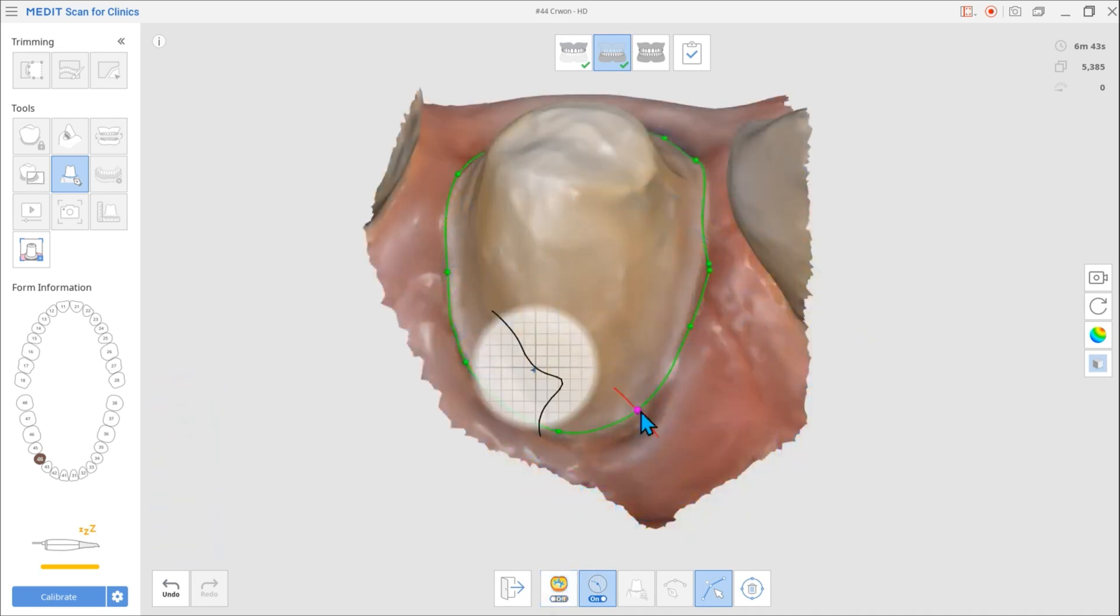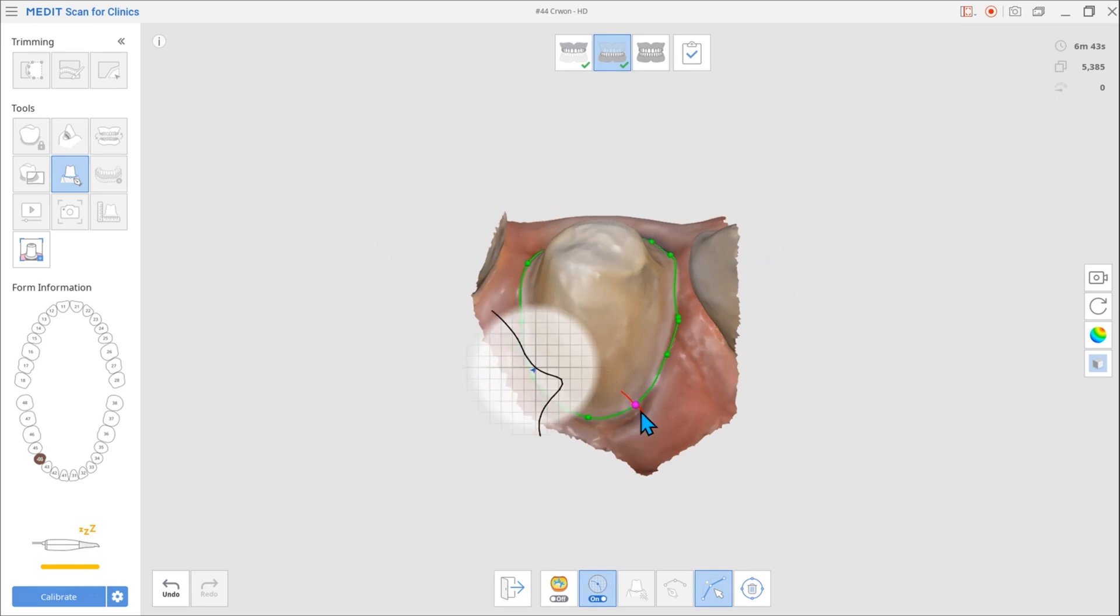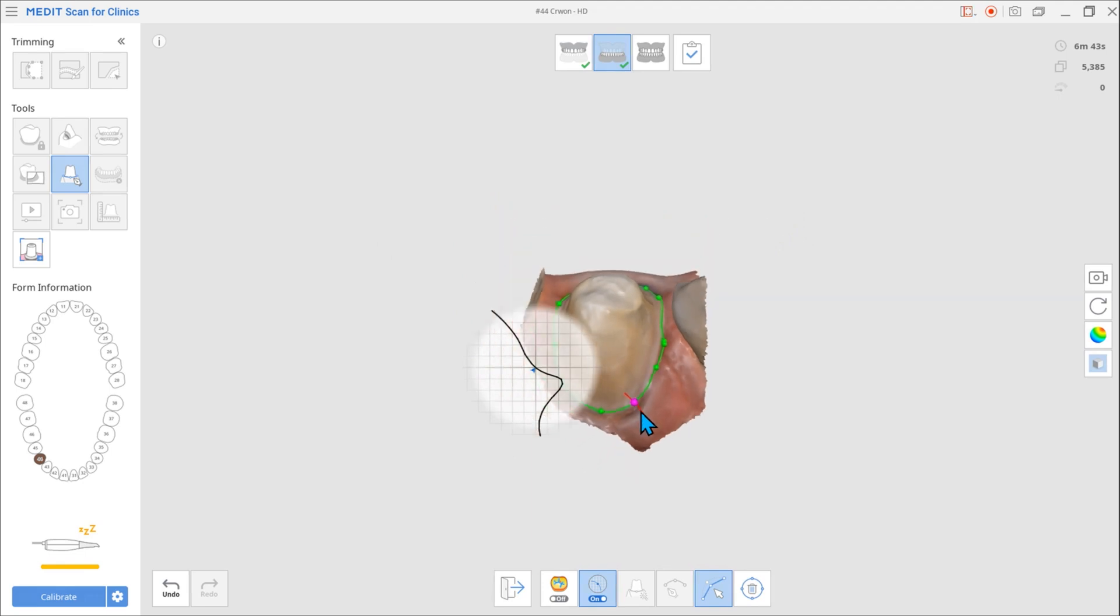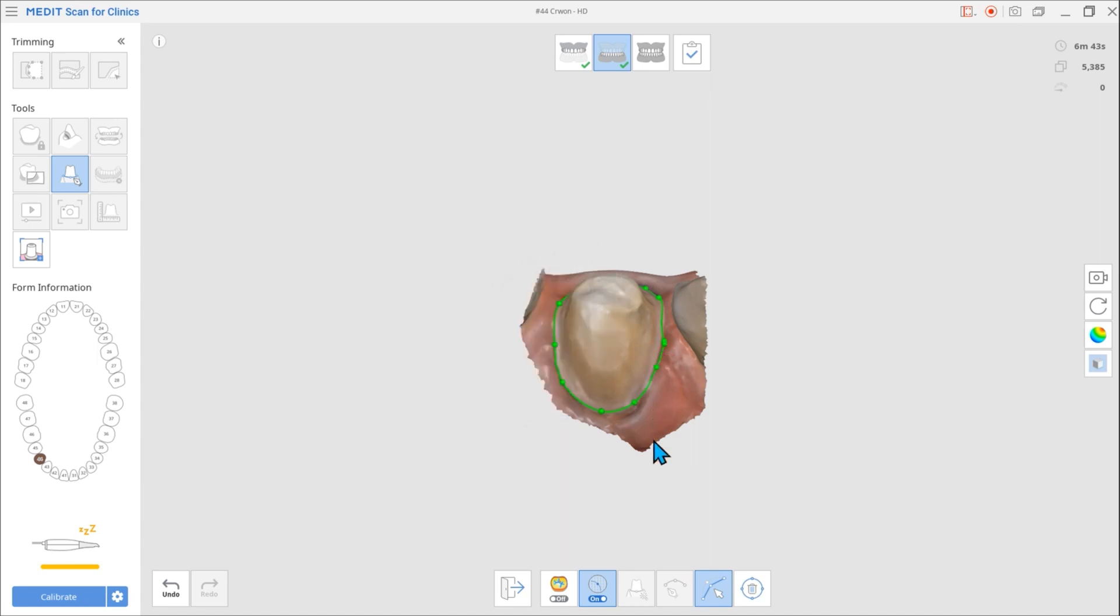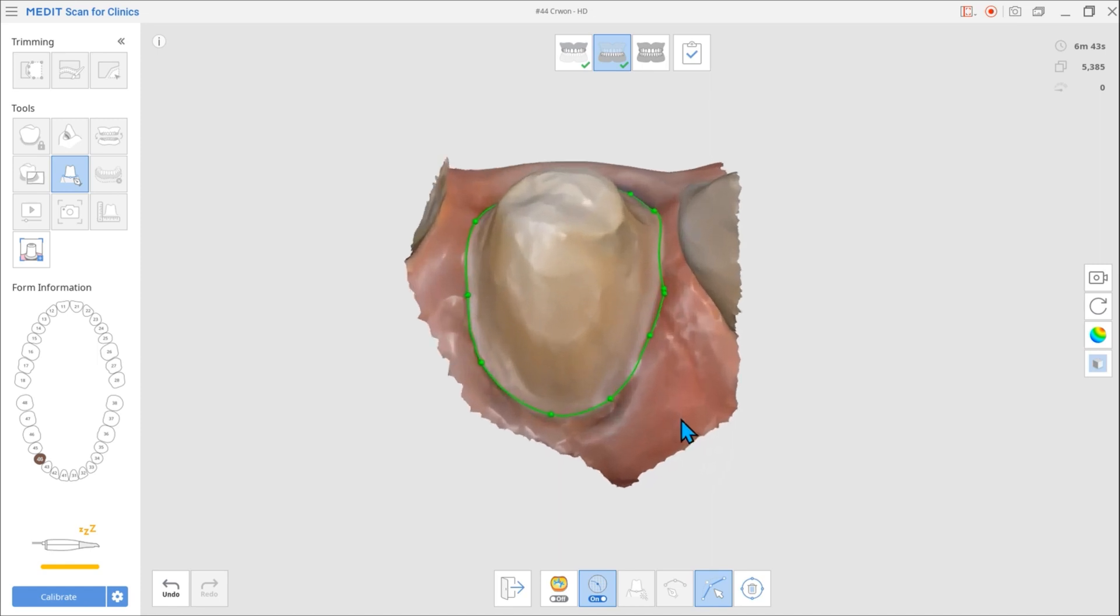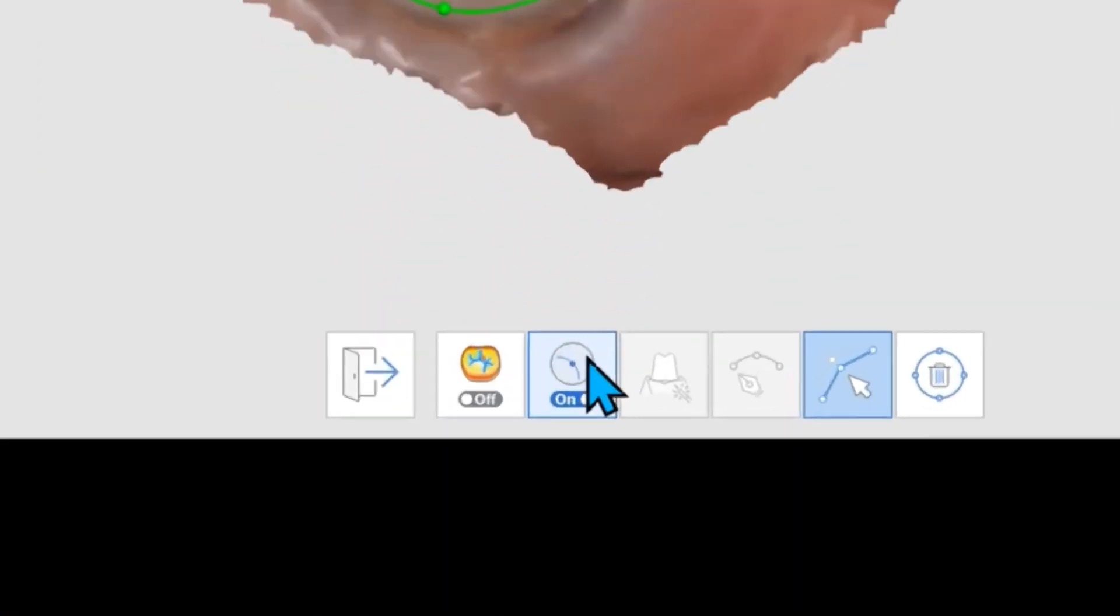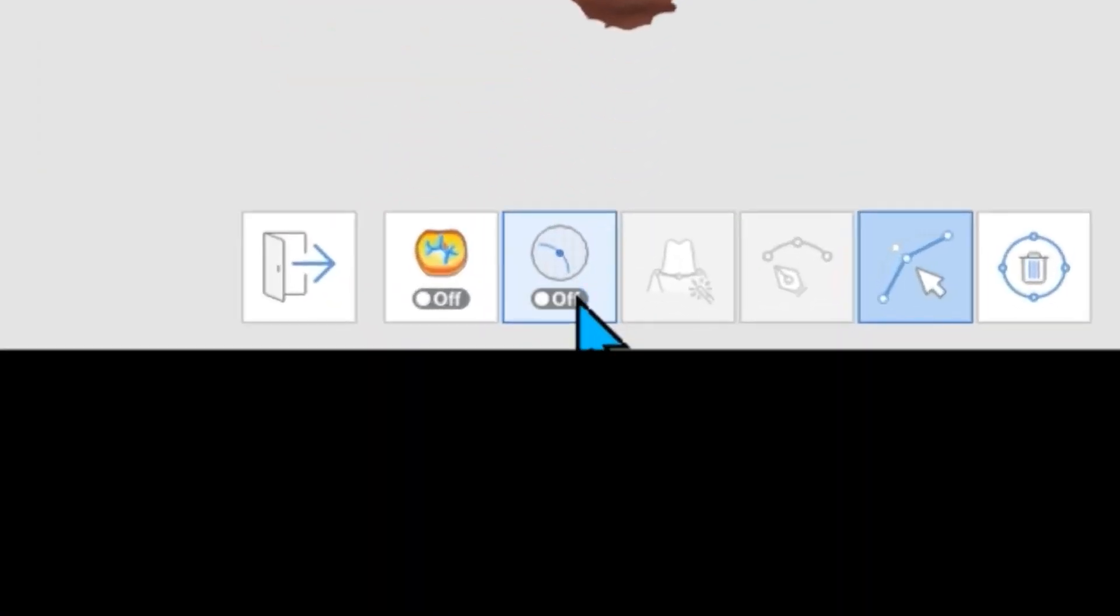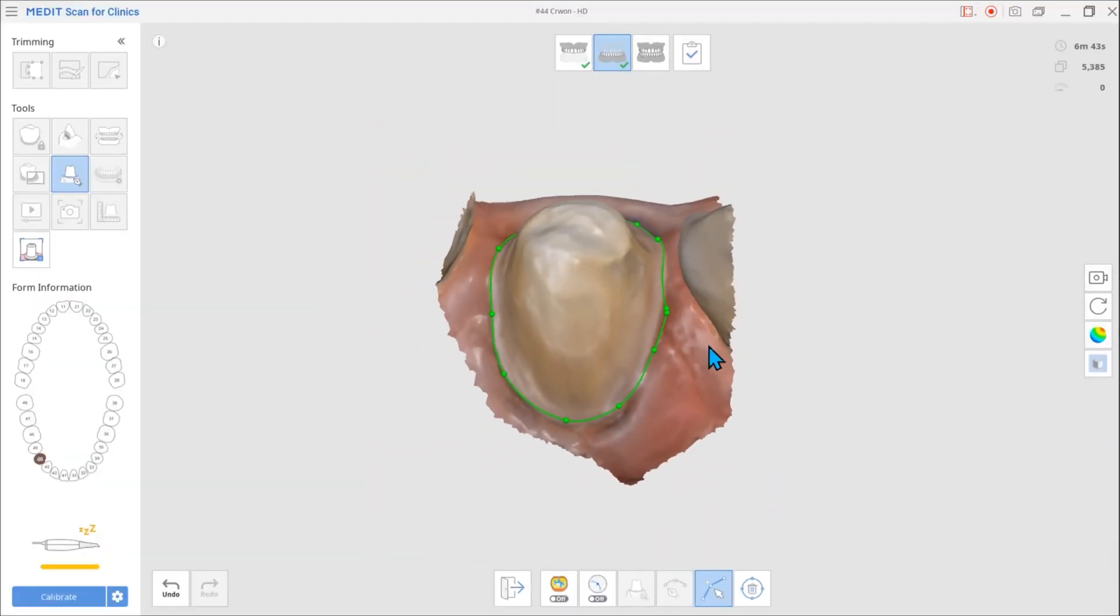Additionally, the previous version automatically showed you the cross-sectional display when the mouse pointer was on the margin line. However, we received user feedback that this display sometimes obscured the areas they needed to see. We applied this feedback and added a toggle so that this feature can be turned on and off.